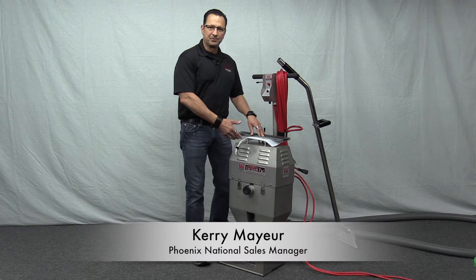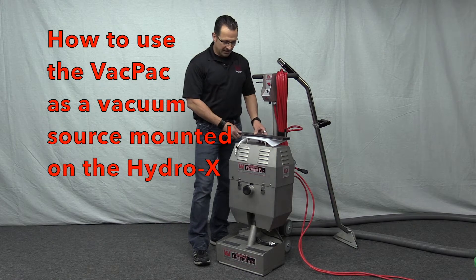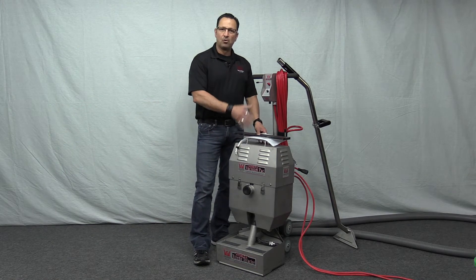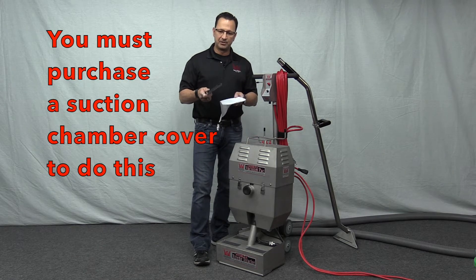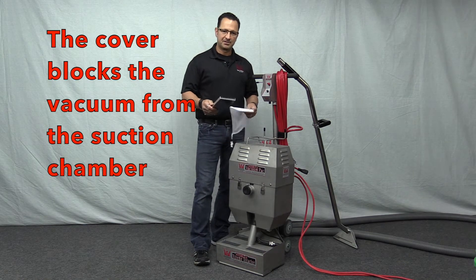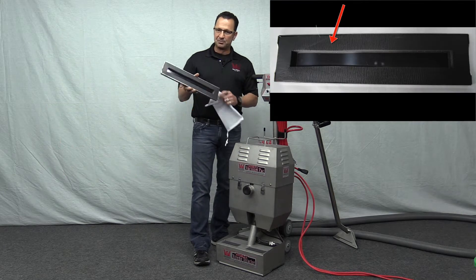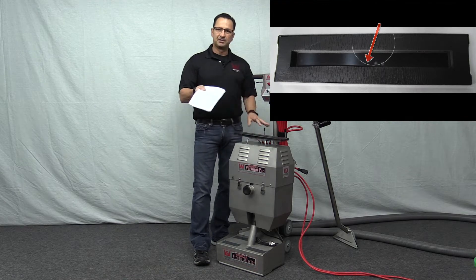One of the ways you can use the Hydro-X vacuum pack is as a portable vacuum source. In order to do that with the vacuum pack mounted on the Hydro-X, it's necessary to purchase a suction chamber cover. This blocks the vacuum from the suction chamber on the Hydro-X and applies it to the front of the vacuum pack. The kit comes with the suction chamber cover, a gasket, and an extra lint sock.